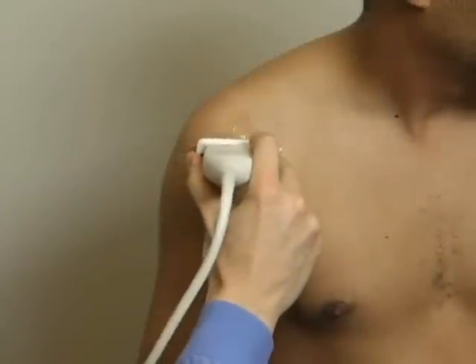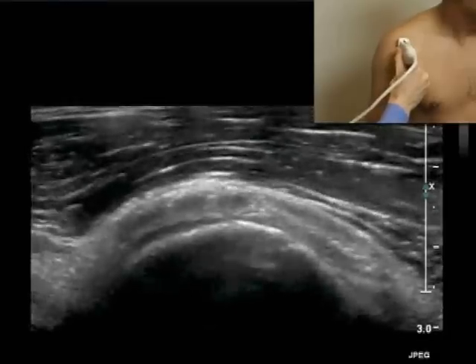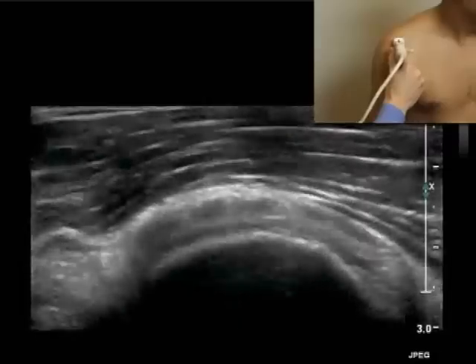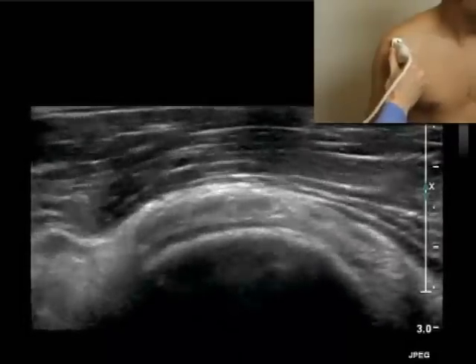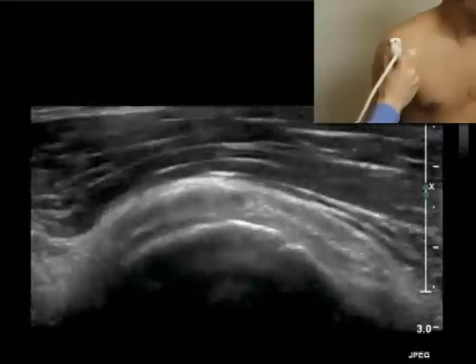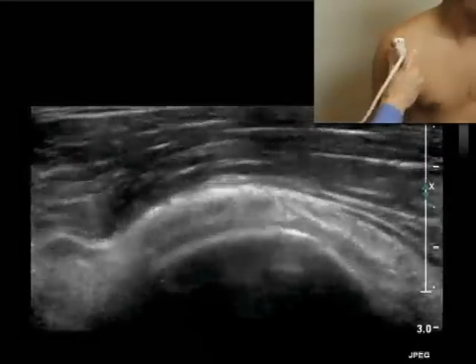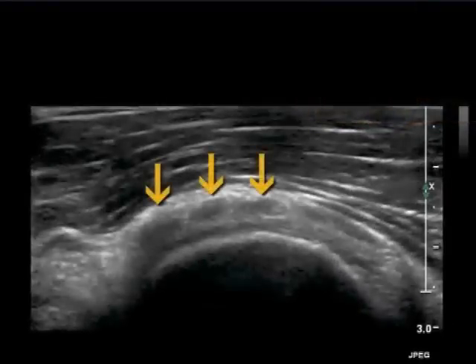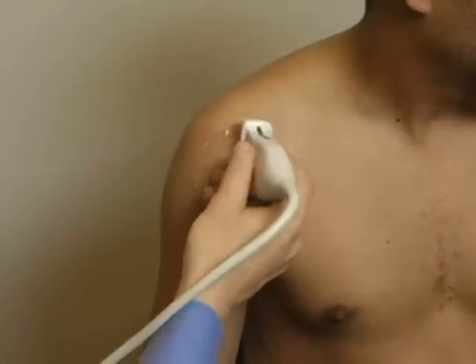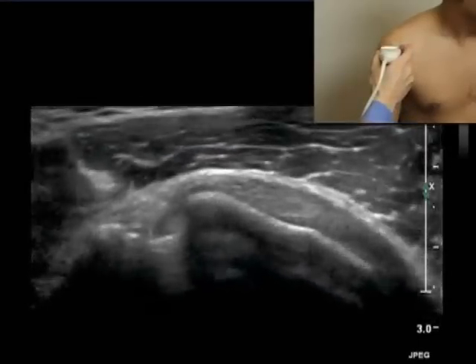With the shoulder still in external rotation, the transducer is rotated 90 degrees to then evaluate the subscapularis tendon in short axis. Note the normal heterogeneity of the subscapularis, as hypoechoic muscle is seen interdigitating between the tendon bundles at the musculotendinous junction. Note how rocking the transducer along the long axis of the tendon causes the tendon to appear artifactually hypoechoic from anisotropy.